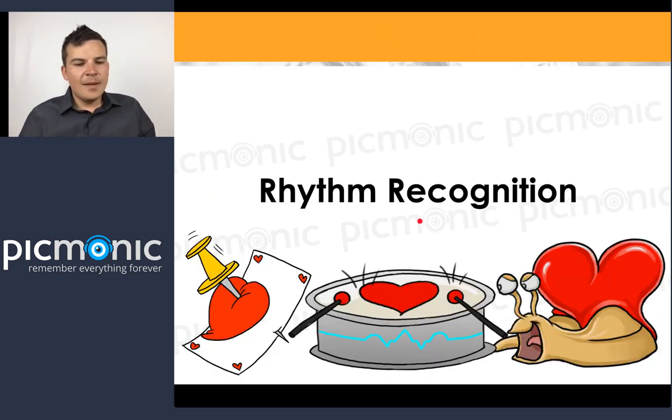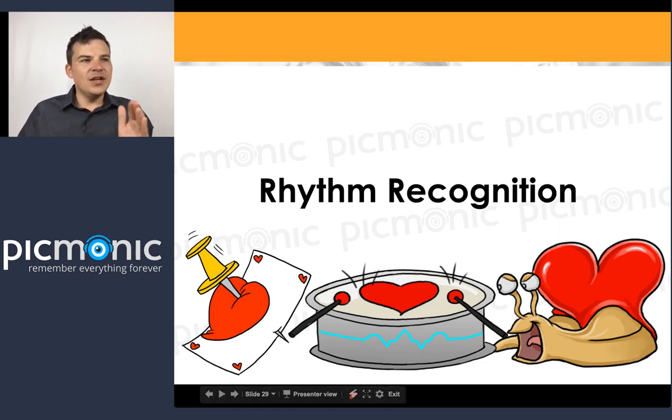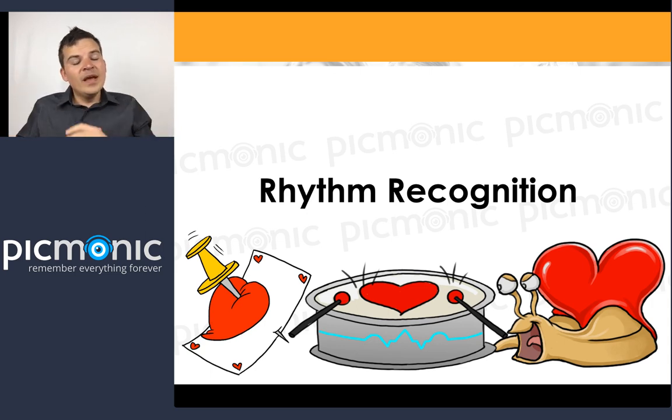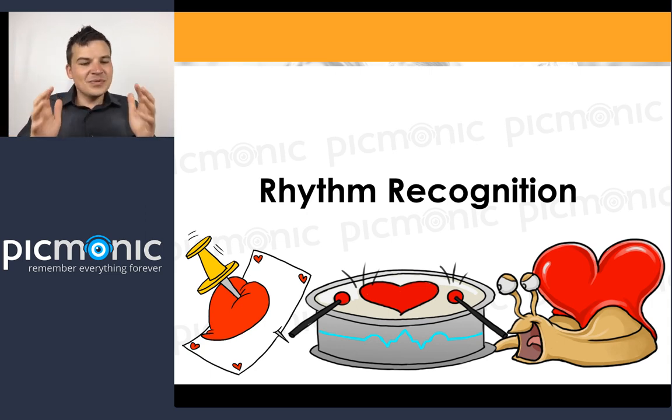But first, when you're learning any type of new skill, and I'm not somebody who usually harps on so many basic things, you've got to learn a process. It's just like baking a cake, doing ECGs. It's like doing anything. You've got to follow a very certain pattern. Otherwise, you're guaranteed to make mistakes, because you'll keep ending up asking, what do I do now? This one looks weird. That's what's going to happen to you if you don't follow the pattern. And we've got a pattern here for you.